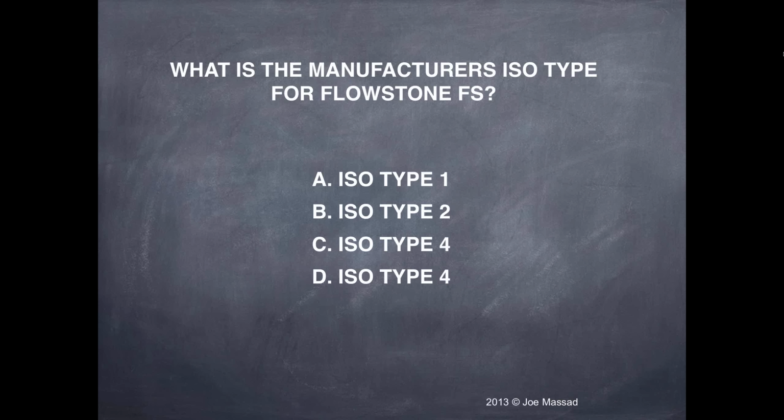If it's a large tray, it may take up to 35, 40 seconds. But you need controlled heat. You don't want to start the heat cool and raise it. We go at 165, drop it in. An average tray generally takes 15 seconds. And you test it, and when you know that's it, then put it back in the water.